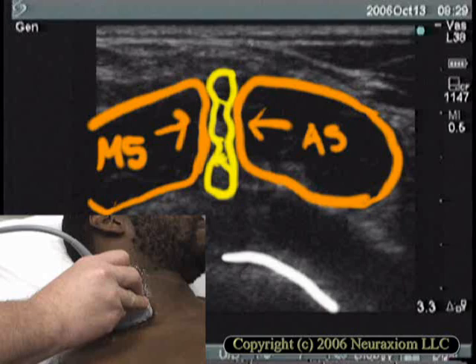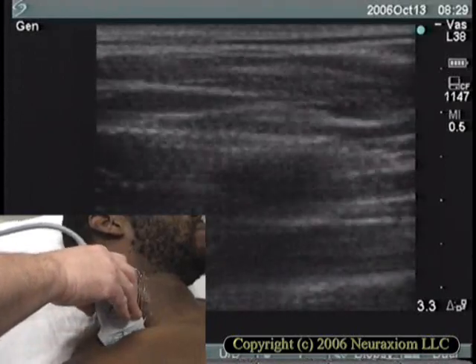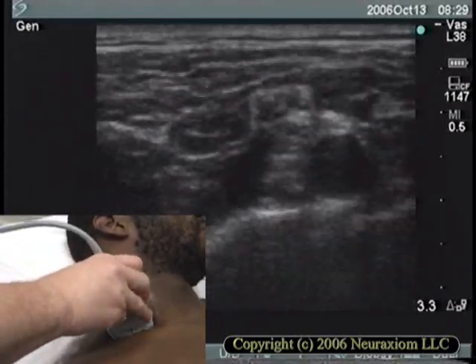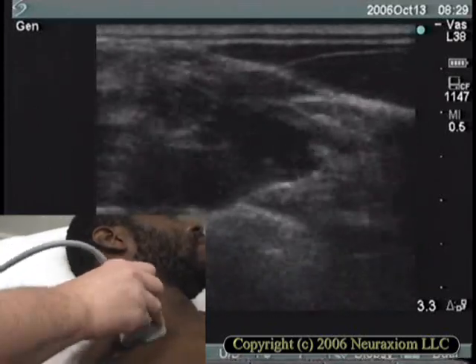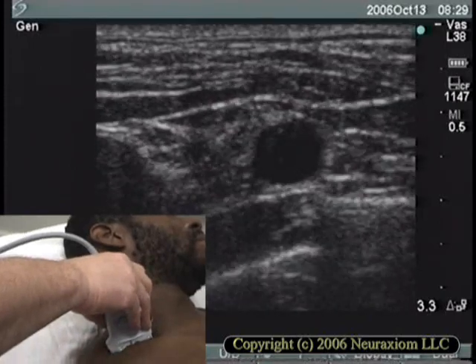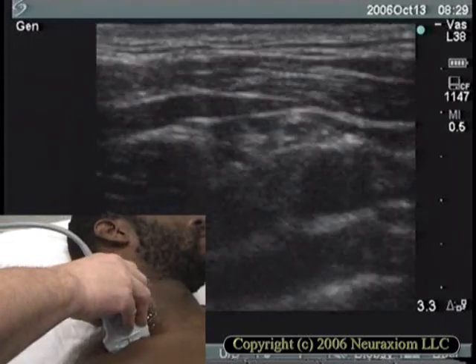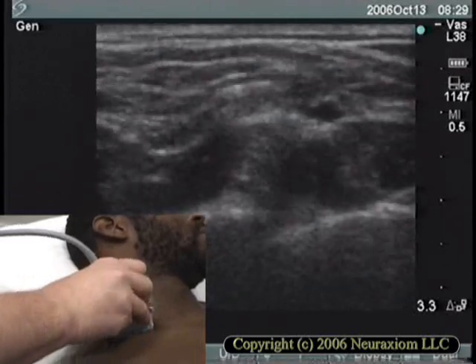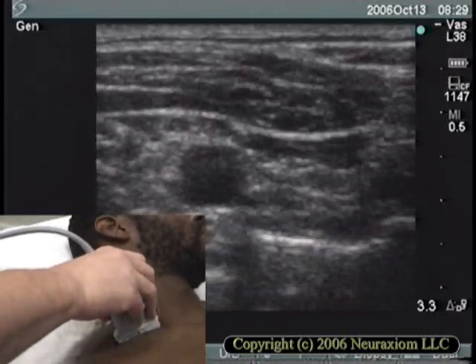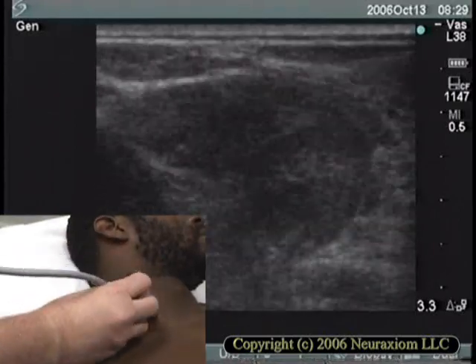Now without stopping, we'll perform the same scan at normal speed. Let your eyes pick out and follow the progress of the brachial plexus bundle as the probe moves. When the probe is in the supraclavicular position, focus your attention on the area just above and behind the subclavian artery. Your eye will naturally follow the nerve bundle, which looks sort of like a group of bubbles. If you're having trouble picking out the bundle during your own scans, consider moving the probe faster back and forth along the path rather than slower — your eye will pick out the persistent structure of the bundle against the changing background.